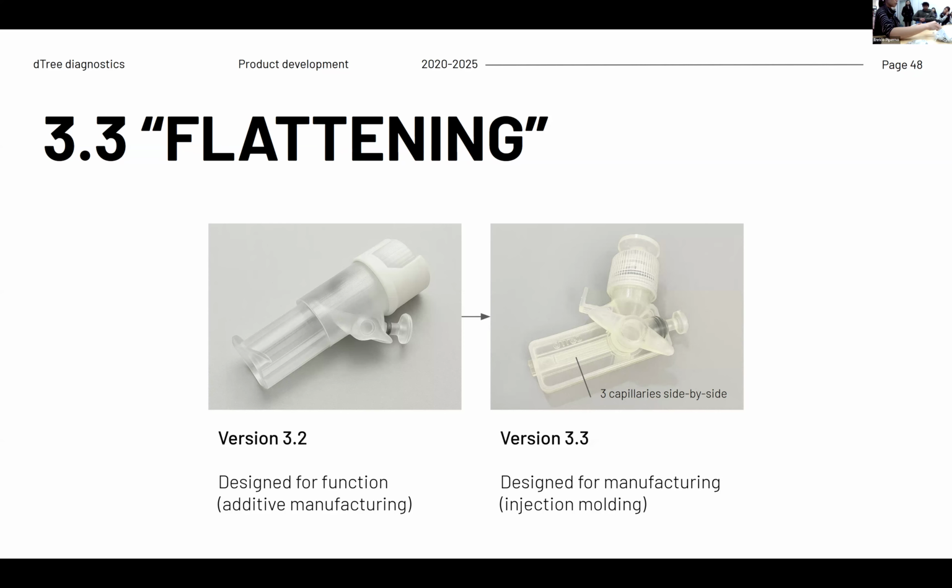Some of them still have the double plunger. Some of them have the single plunger. This is when I'm just trying to test one element. Say the cap was not sealing, so I don't want to print the whole thing, I just want to test the cap. So sometimes that works too. Like for example, see, I'm just testing the top of it. Yeah. It's inside the device.